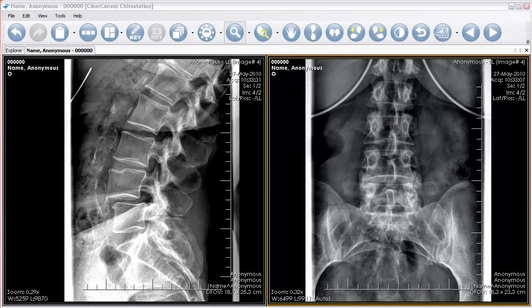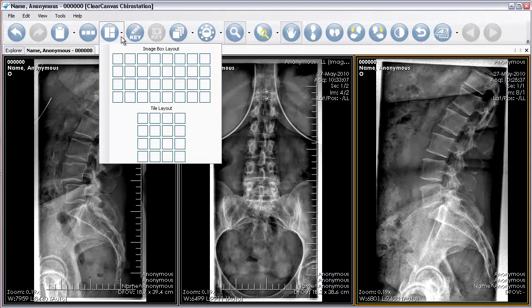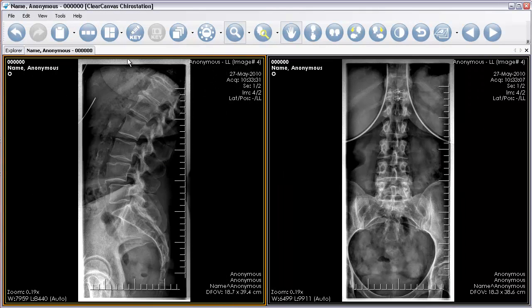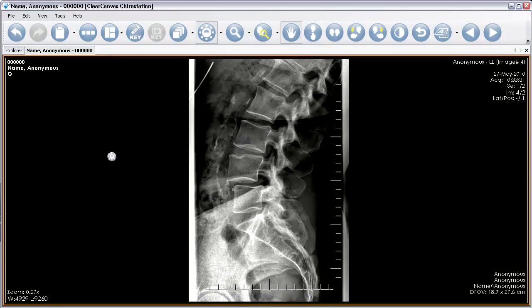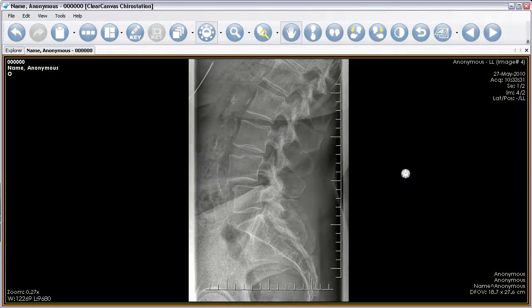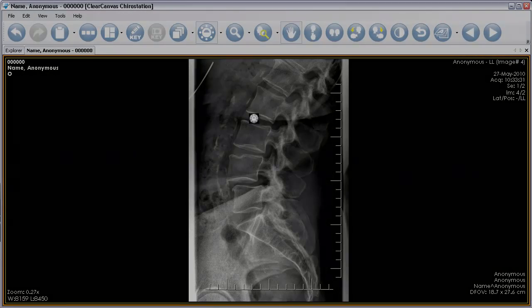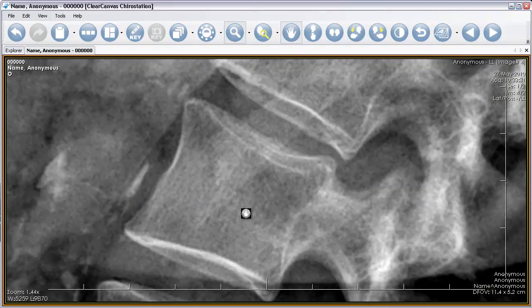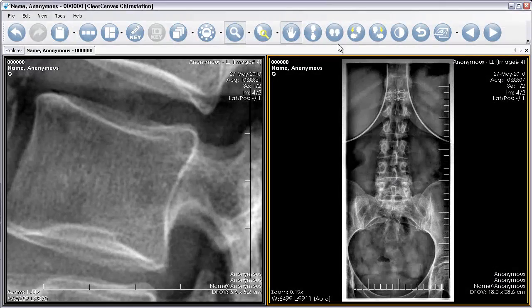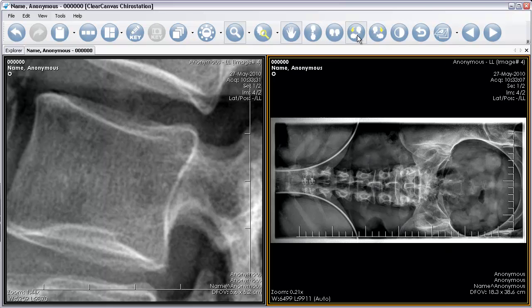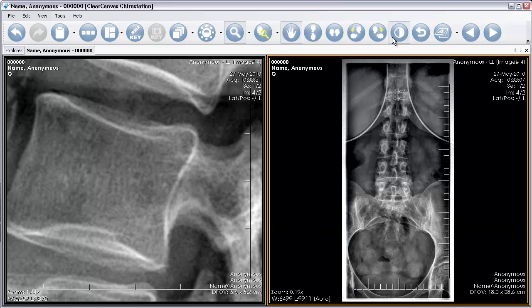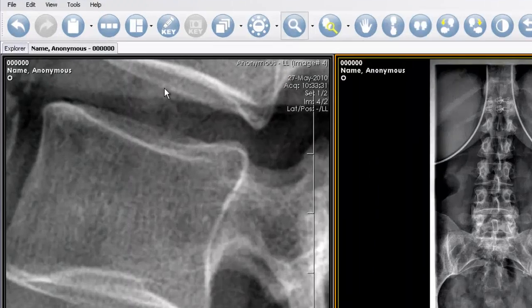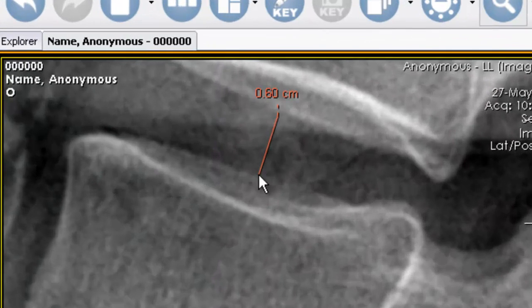ClearCanvas ChiroStation includes many of the standard features that our radiology workstation has, including layout, window level, zoom and pan, flip and rotate, invert, and measurement tools, all packaged in a streamlined, easy-to-use interface.